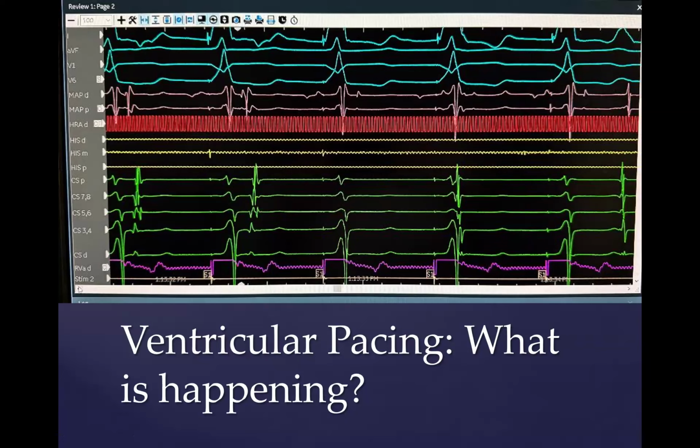In the past, if the pathway were not to come back during the procedure while we were waiting, we would have to basically burn based on where we thought we were on fluoroscopy, which, as you could imagine, is not anywhere near as accurate as using CARTO, which claims to be accurate within 1 to 2 millimeters in terms of location. And that is one of the theoretical benefits of CARTO over its competitor, which is made by Abbott.